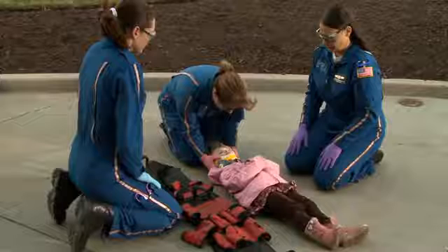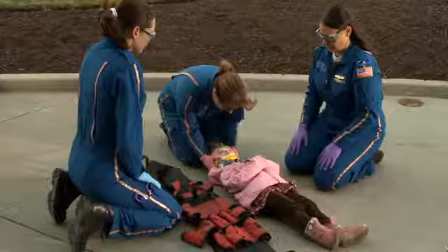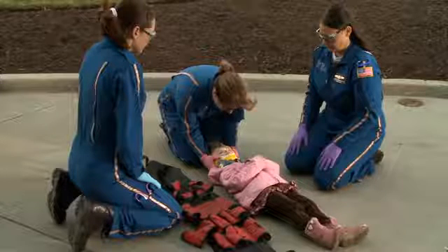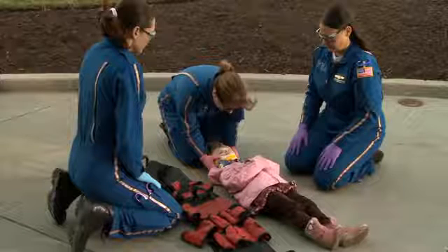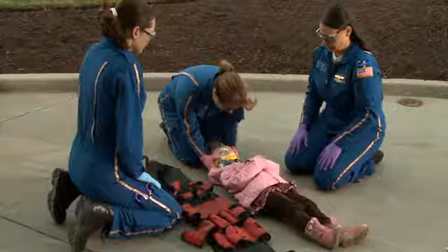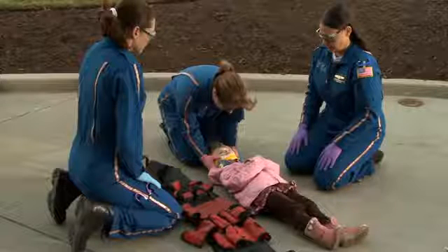A third provider places the longboard near the patient. The first provider kneels above the patient's head and maintains neutral inline stabilization of the patient's head and neck. The second provider kneels alongside the patient between the patient's shoulders and hips and straightens the patient's arms and legs if needed. The third provider will place the immobilization device alongside the patient on the side opposite of the second provider.